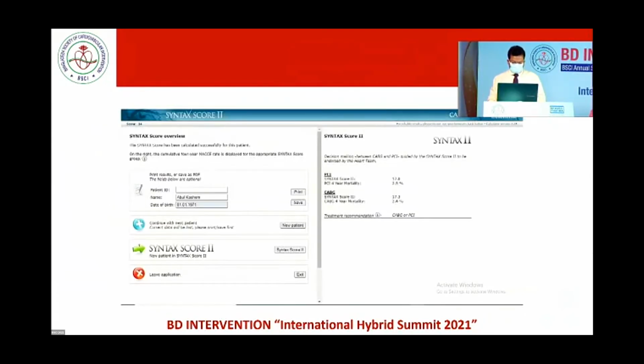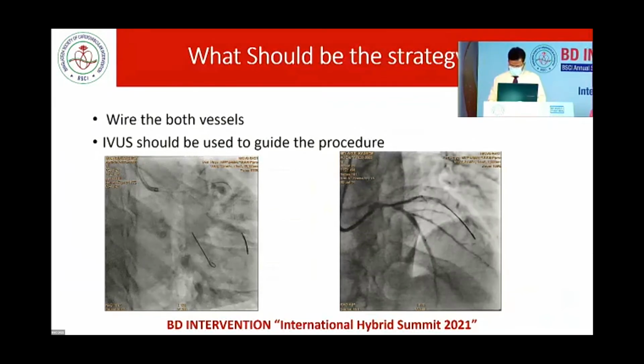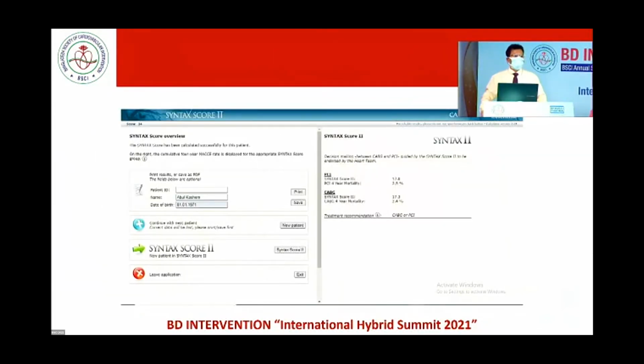So what should we do? Can you tell me the decision from the panels, what we should do? In diagnostic angiography, it looks like a critical lesion in the ostial circumflex extending just up to the proximal part, and plaque in the distal left main, and apparently the LAD is healthy. And the patient is typically symptomatic. He can't walk a few steps. What should we do? Whether keep him on drug treatment, or we should do some intervention.